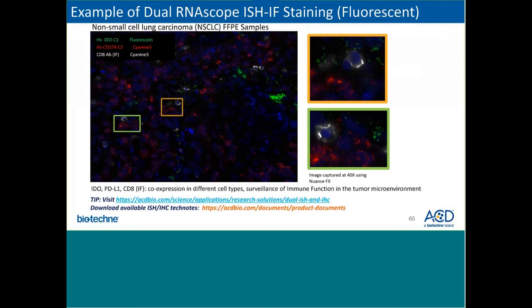Another example of the dual RNAscope assay with 2 mRNA markers followed by immunofluorescence staining. The IDO1 and PDL1 RNAscope markers are stained in green and red, respectively, while the CD8 antibody is stained in white with Cy5 using the multiplex fluorescent V2 assay.